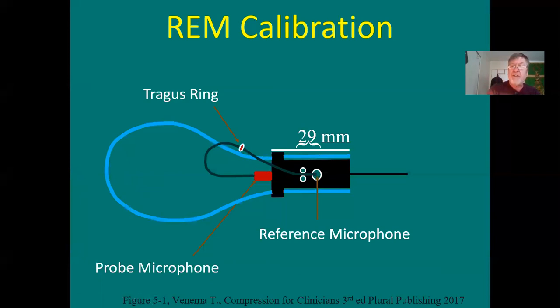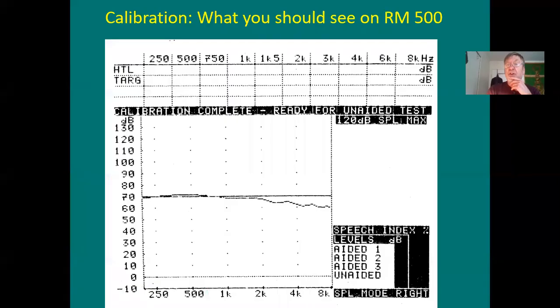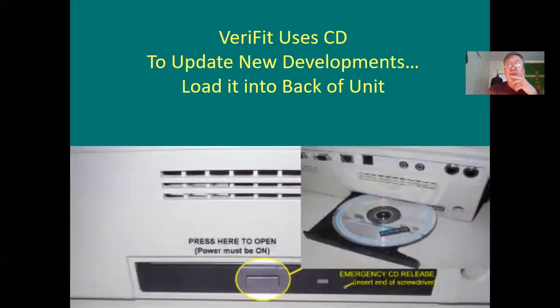You do that after you calibrate. You do that to make sure, and this is just a picture of calibration being complete on one real ear system, but don't worry about it. This is a stupid picture, so is that one.